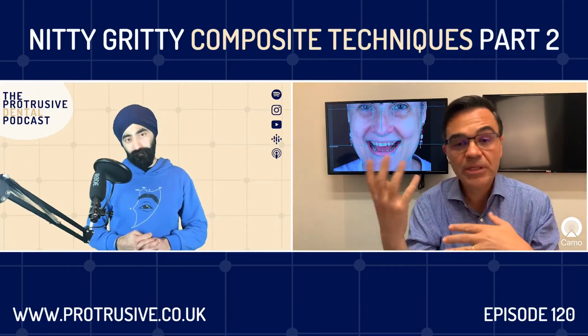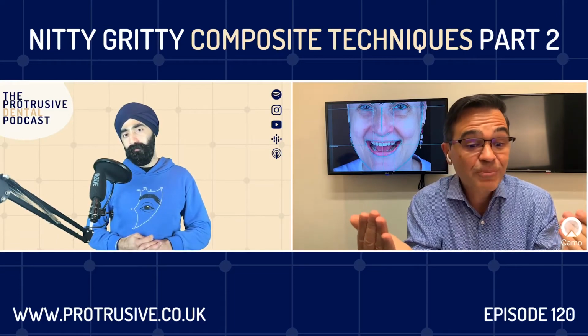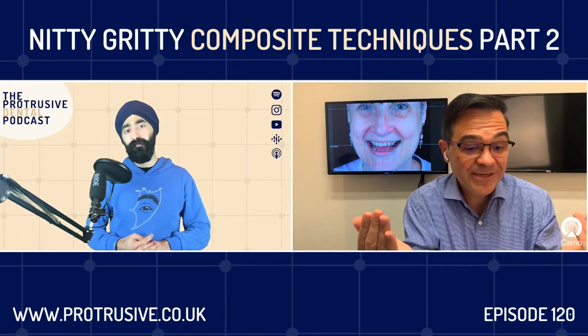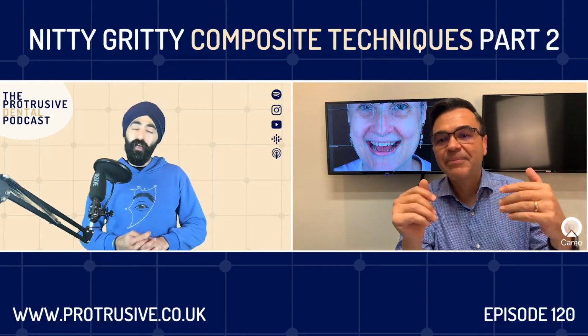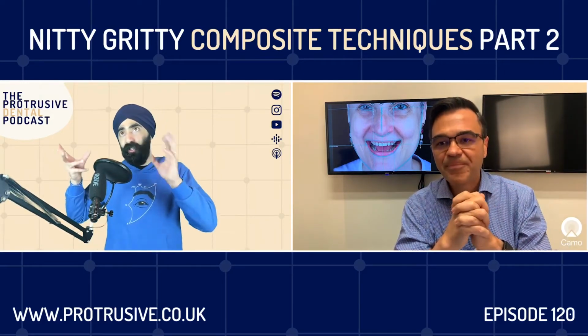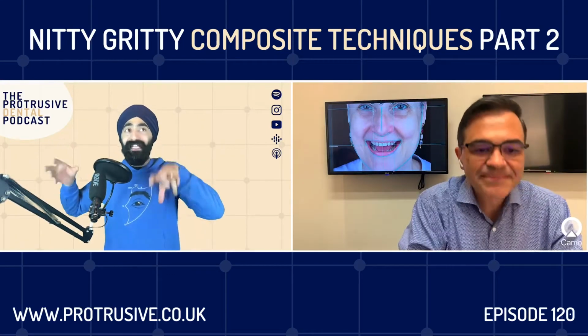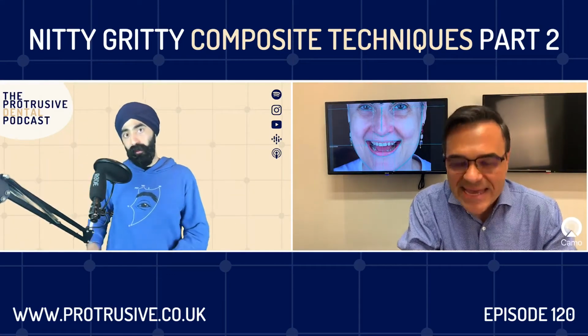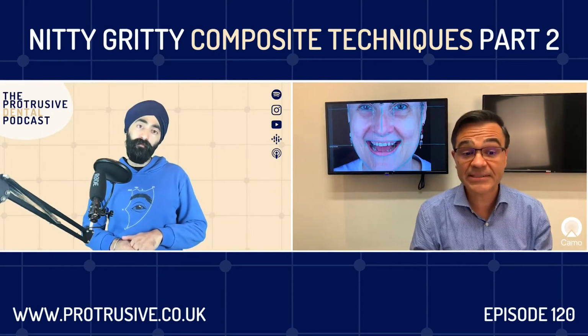Okay, so I can do it with Dana articulators, just like Dr. Patel. I think Dr. Patel uses Dana as well. Yes, he does. Yes, we love Danas here. But so you're mixing digital with analog, right? You're taking an analog Dana Facebow and you're just adding it to the printed models, right? Yes, exactly. With my digital smile design, Jazz.